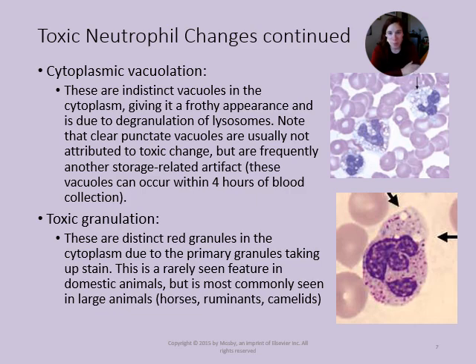Again, it's not common, but that can happen. Now, what would the lab do? Well, if the lab saw this or there was an issue within the patient, hopefully they could run an additional test to rule some of this out.